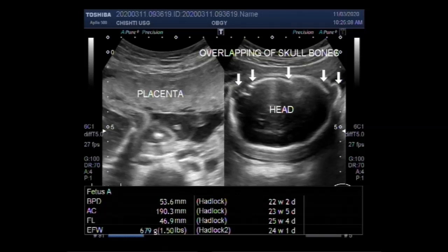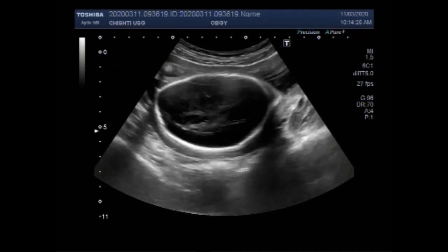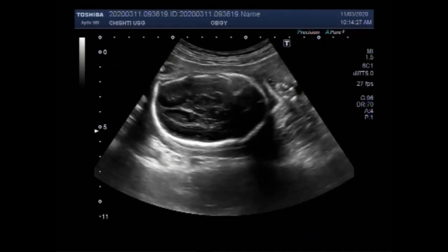Dear Waves, I hope you are all fine. This ultrasound video shows a pregnancy with fetal demise and positive Spalding sign is seen.